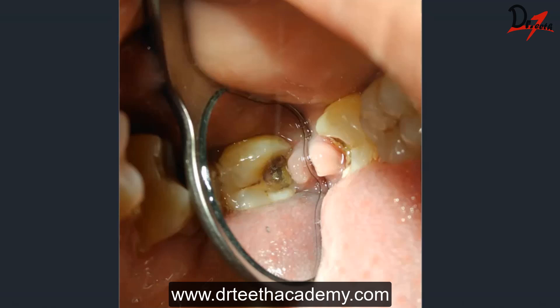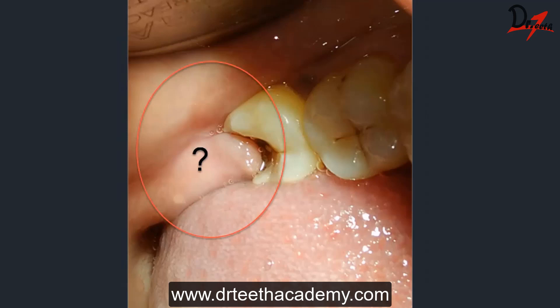As you can see, there is distal caries on the terminal molar. The challenges here are: the tongue is quite large and elevated, there is less vestibule space on the buccal side, and we can see some gingival encroachment on the caries area. This gingival overgrowth is encroaching into the space cavitated by the caries process. All in all, this is a challenging case.